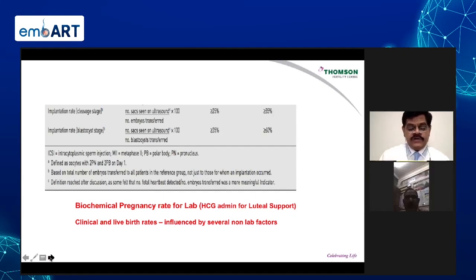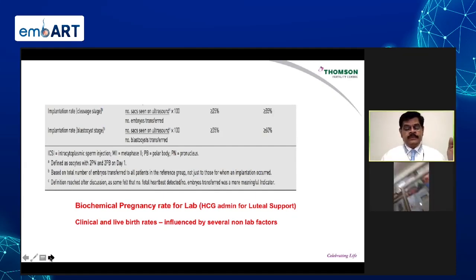And I would say that sometimes, do you really need to look at the pregnancy rate as an outcome of the laboratory? Because the pregnancy is controlled by a lot of other factors. With that kind of condition, I think the pregnancy rate shouldn't be truly reflecting what's done in the lab. So you may be happy with how many usable embryos are produced.